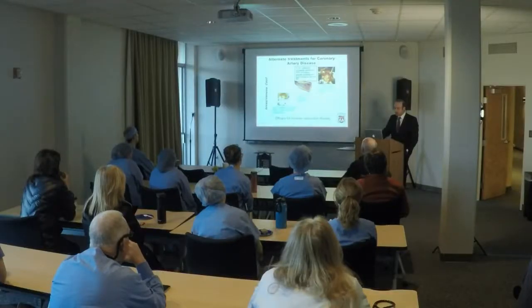So we're using a diagnostic test where it's providing actionable data, we're intervening, and that's translating into a reduction in hard clinical endpoints. It's hard to show that with non-invasive tests these days, but we have strong data now using coronary CTA.